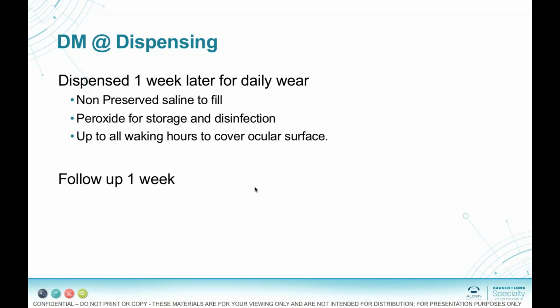And then my feeling at this point, because of how bad her epithelium looked, was I wanted her to wear the lens essentially all waking hours to cover that ocular surface. And again, standard procedure for me in many cases, that's how I like to do it, is to have the patient wear the lens as much as they can to shield that ocular surface from the external environment. Follow up in a week.